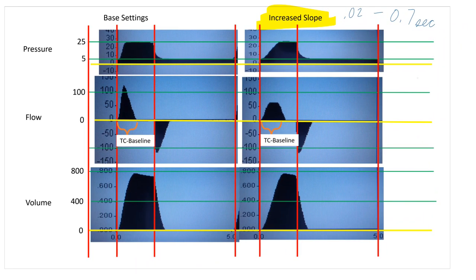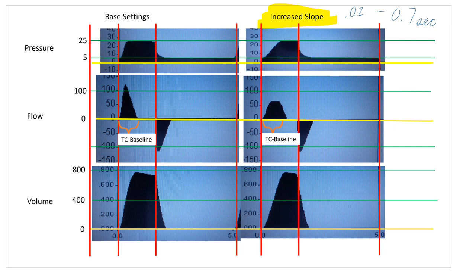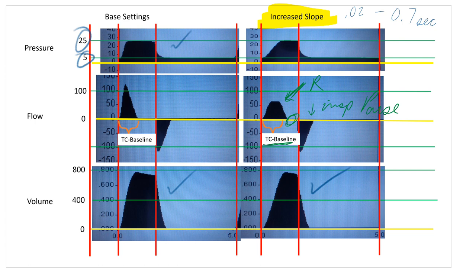By increasing the slope from 0.2 to 0.7 seconds, our inspiratory flow was dramatically reduced and smoothed out. You'll notice our time constant — the time to reach equilibrium — was expanded, so we actually have a decreased inspiratory pause, giving less time for distribution of ventilation. We're still achieving pressures of 25 over 5 and the same pressure gradient. Because we still reach equilibrium between mouth and lung pressures, tidal volume is maintained, but inspiratory flow has been decreased and softened.